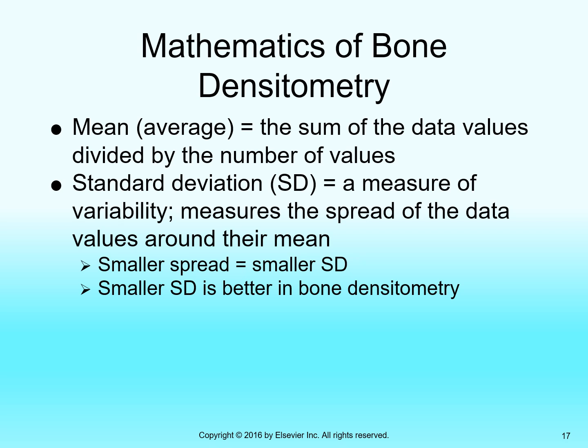Because it removes differences caused by variability. Did the patient shift position? Did you not center them appropriately? Did they take a breath when they should have blown their breath out? Those types of variances can affect tissue density and position and can also introduce motion if the patient's not paying attention. And so they can affect the measurements. But if you're averaging multiple measurements, you can get rid of some of that variance.